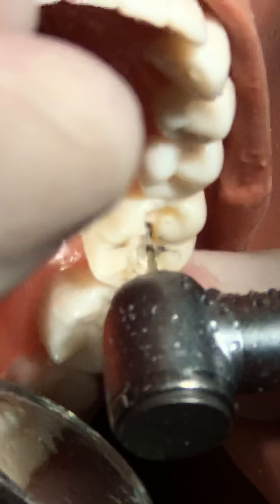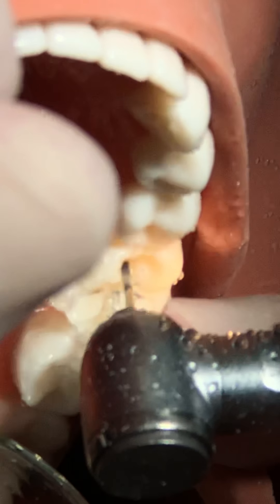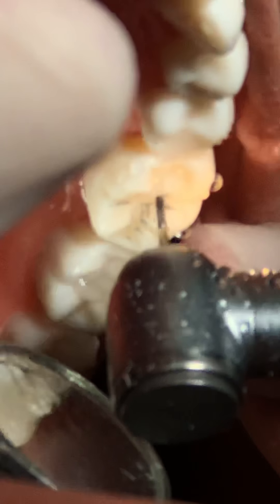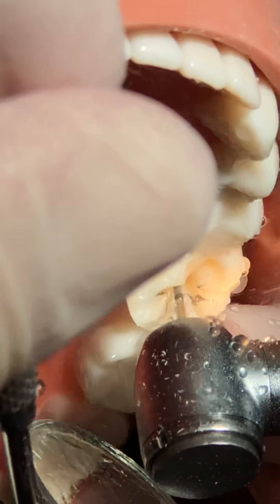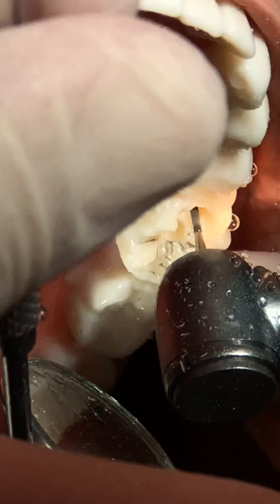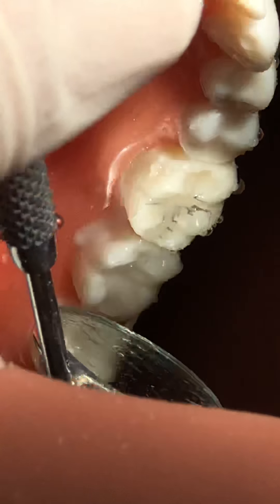The pulpal floor is fine. Do it step by step - it's much better when you're done with the occlusal part before going to the middle. We'll check it again to see everything is okay.